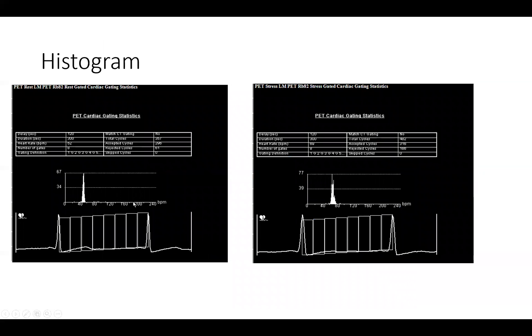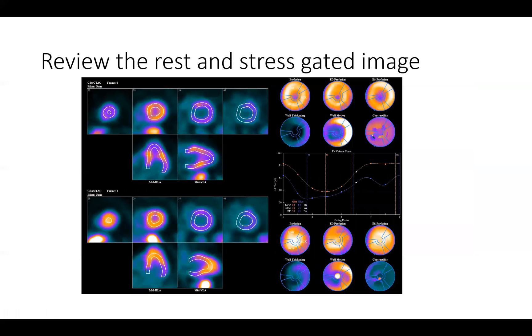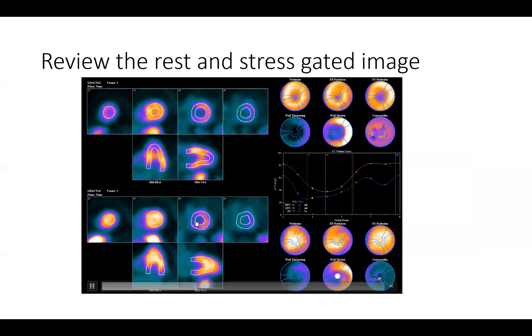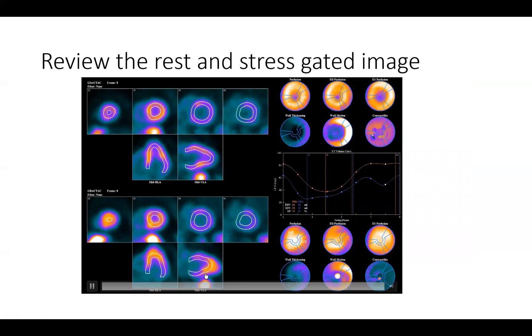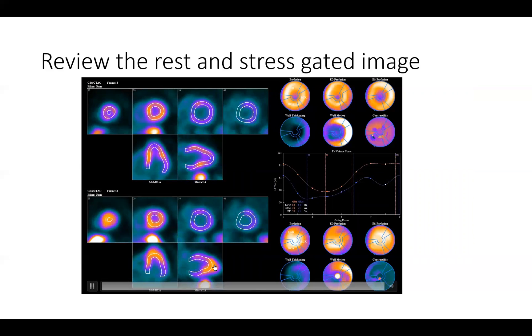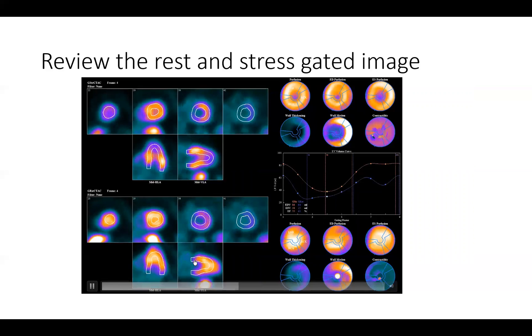We go next to the histograms. You can see the rest histograms and the post-stress histograms — these are important QA images to make sure that we have stability of the heart rate from rest to stress so we can trust the ejection fraction generated from these images. Then we go to the gated images. On the stress images you have nice contour and nice tracking of the left ventricle, but on the rest images you can see poor tracking — the software could not identify the left ventricular cavity to track.